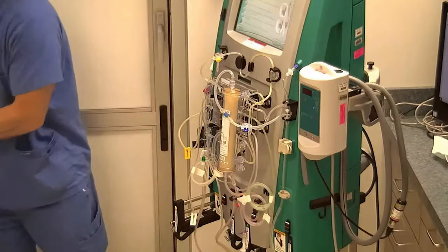So from this screen, we're going to hit adjust chamber. And as we can see, if you can't see, our level is a little bit low. So we're going to press and hold the up arrow, and that fluid level will start to rise. And I'm going to stop when it's right below it, and I'm going to hit confirm level, and we'll see that fluid will go in a circle a couple times. So we're at a good level.